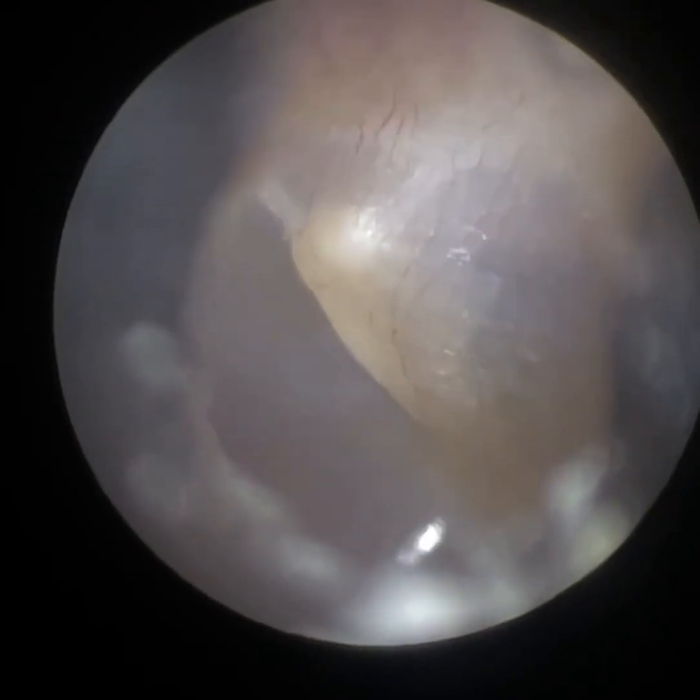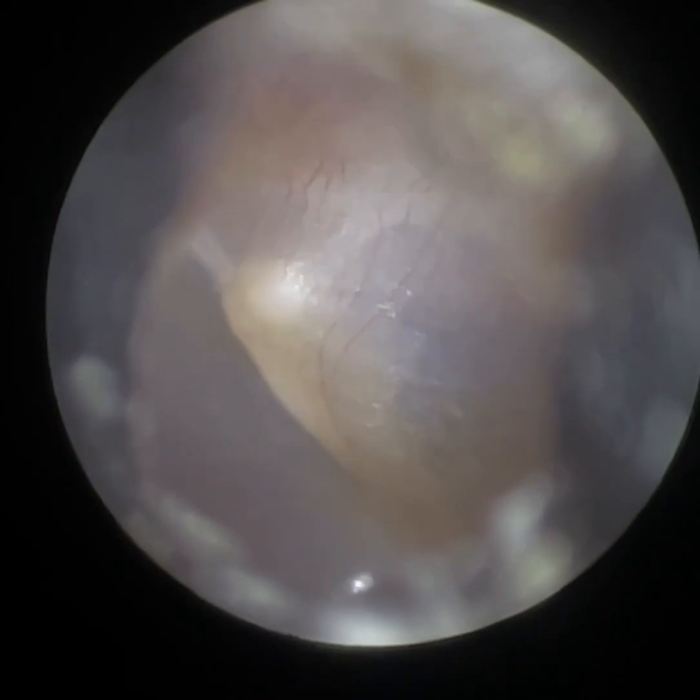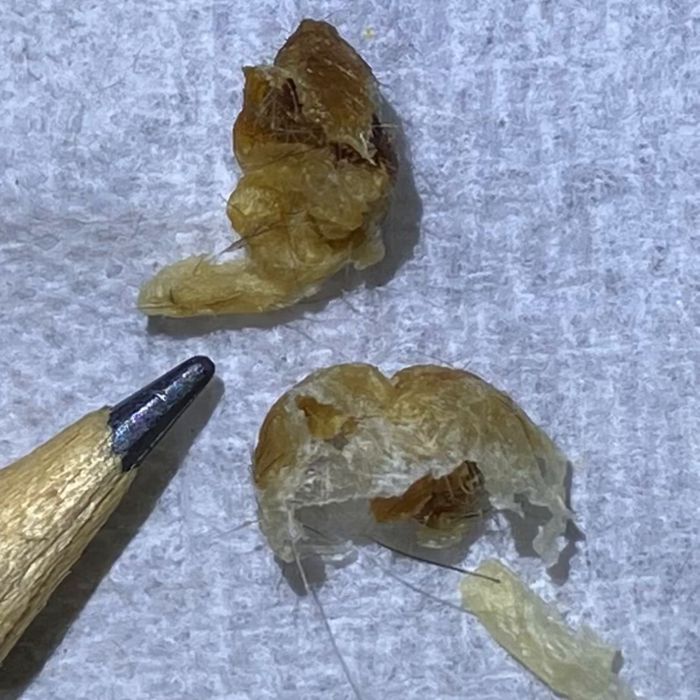This is the patient's left ear again. We've got the eardrum in focus — you can just see the detail there, the micro detail. You can see the radial muscles as well. And once more, you can see the blood vessels that are supplying blood to the eardrum and the hammer bone, the malleus. Those are the plugs of dead skin that were extracted from both ears.